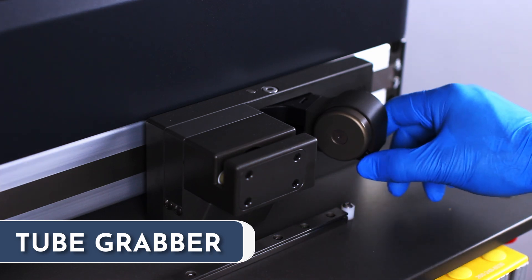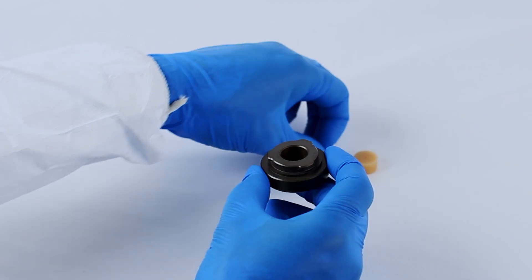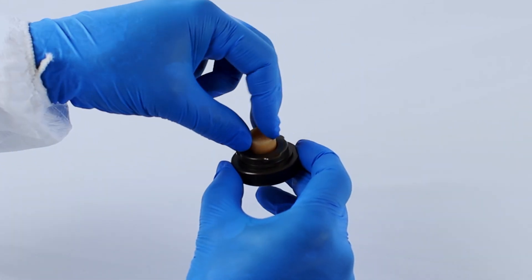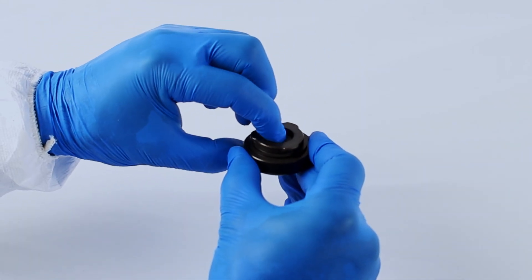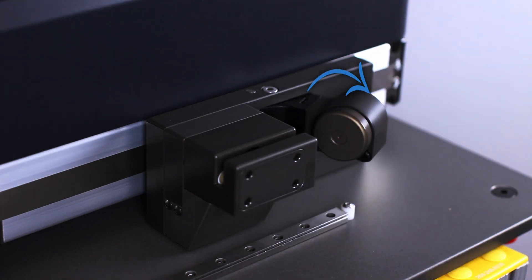On the tube grabber, press and hold the button, then rotate the cover counterclockwise to remove it. Place one washer into the cover, then push the seal in until fully seated. Reinstall the cover and rotate clockwise until the button clicks into place.